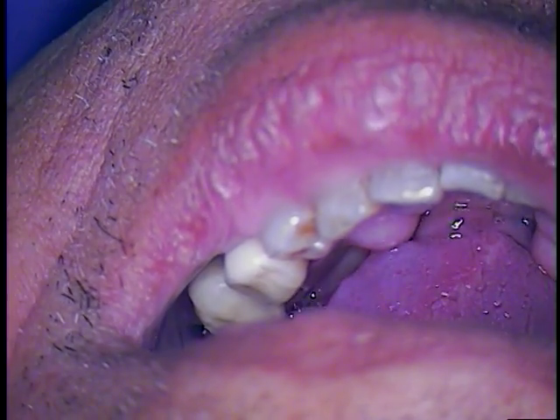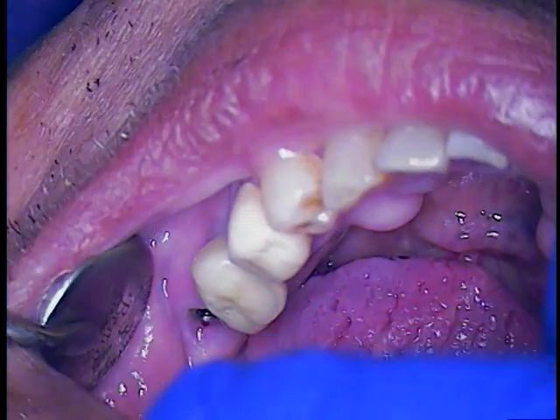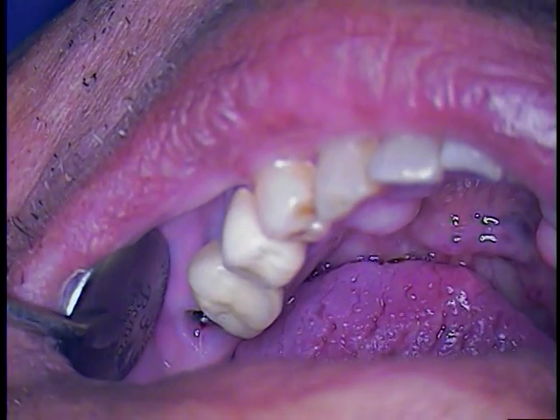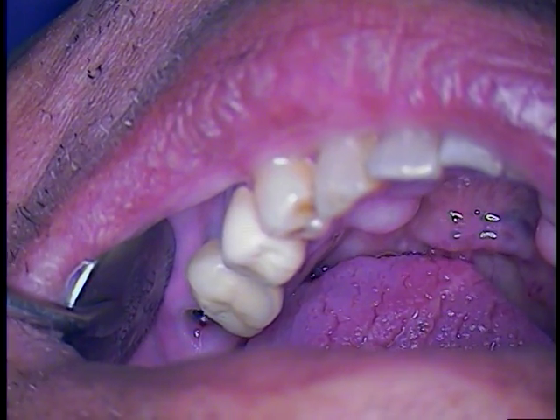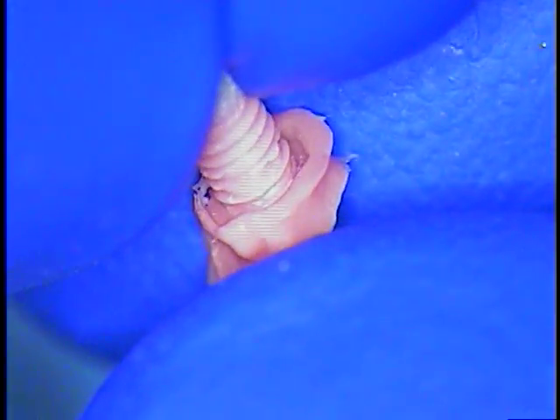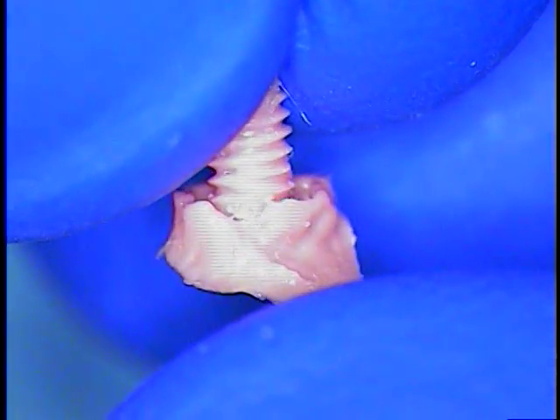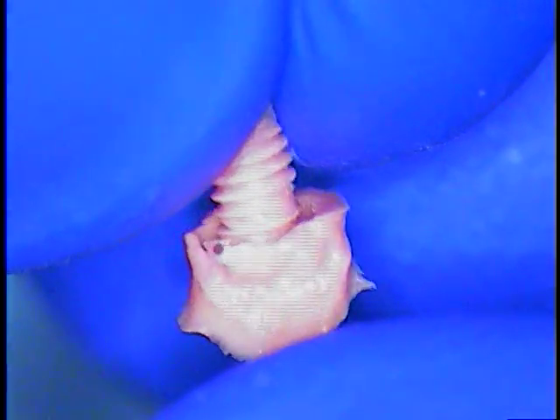I'm back here with the external hex case where the first two threads are definitely showing a marred appearance. Looking at the VPS, we were able to ascertain that it is indeed the first two threads — actually one, two, three. The third one is very much, I want to say, just cross-threaded.